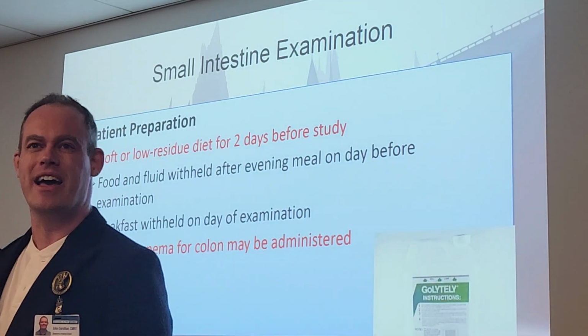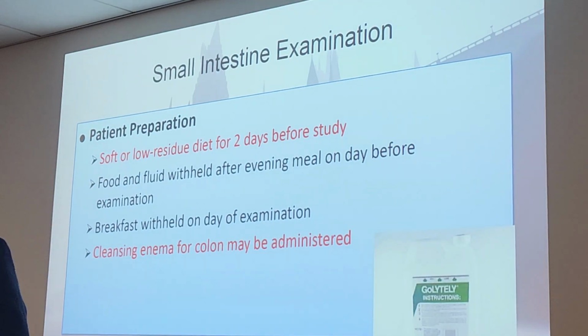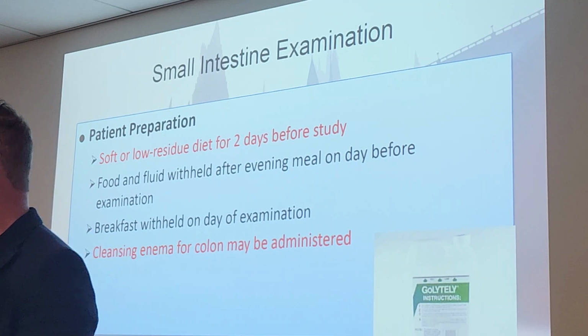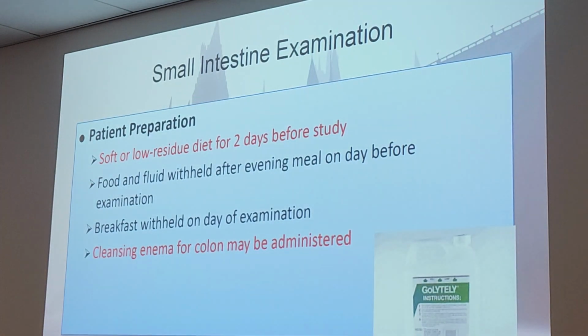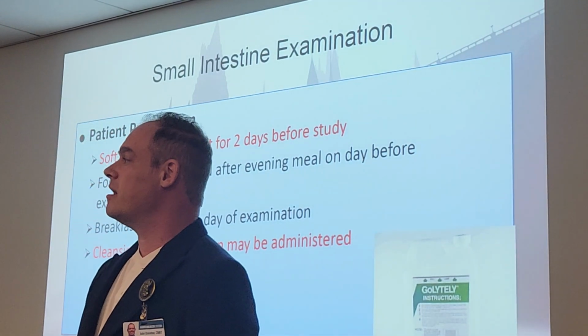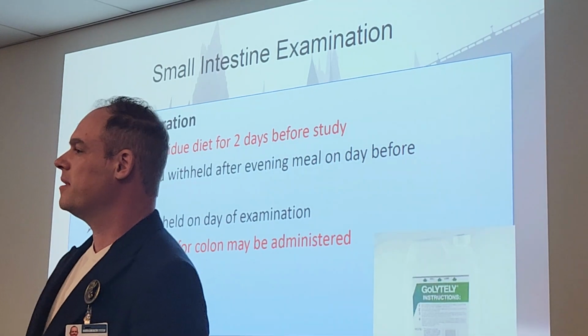Soft or low residue diet for 2 days before the study. Pay close attention to these. These do vary between exams. This is different than the upper GI. Small bowel, 2 days before, it's that soft or low residue diet. Food and fluid withheld after evening meal on day before the examination. Breakfast withheld on day of examination. No eggs and bacon, I'm sorry. Cleansing enema of colon may be administered, but not for sure. Depends on the procedure.